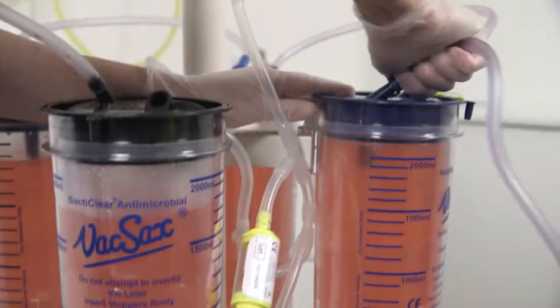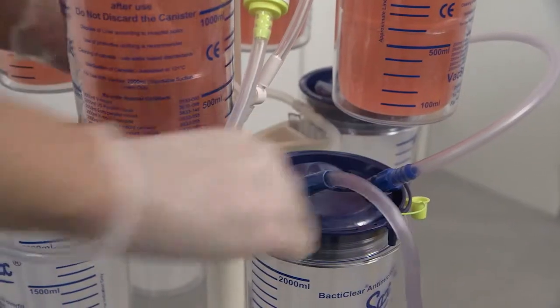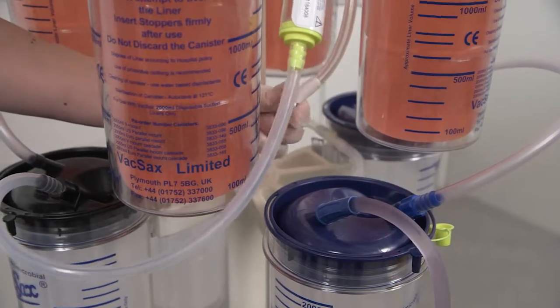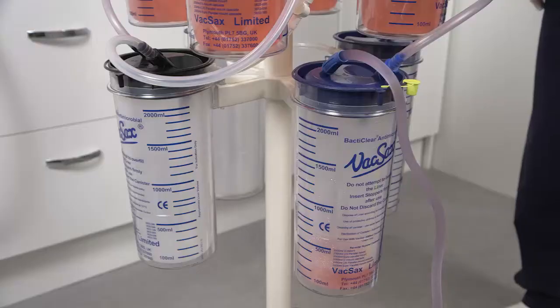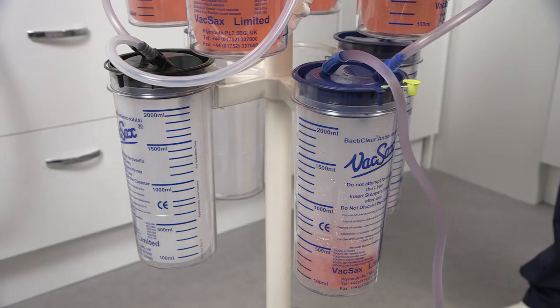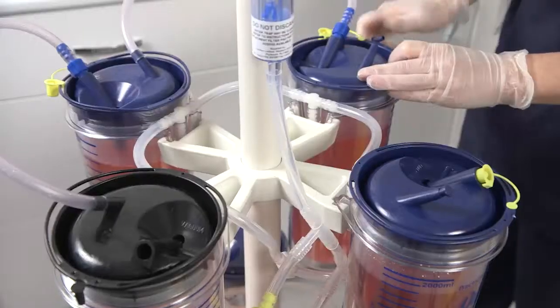Now remove the patient tubing from the top row blue liner and connect it into the bottom row blue liner. Ensure the bottom siphon tap is set to open and close the top siphon tap. The bottom row is now ready to use, allowing the operator to change the top row of liners.